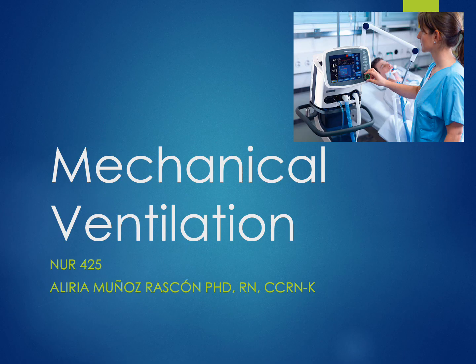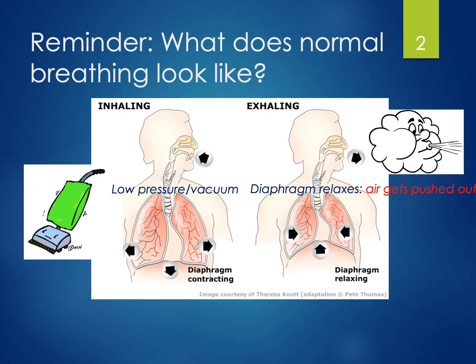This presentation introduces the concept of mechanical ventilation. So we'll explore how ventilators work with your patient and then introduce various types of ventilator settings. Now you should already be aware of the basic concepts of oxygenation versus ventilation as well as work of breathing, but let's get back to some of this physiology.